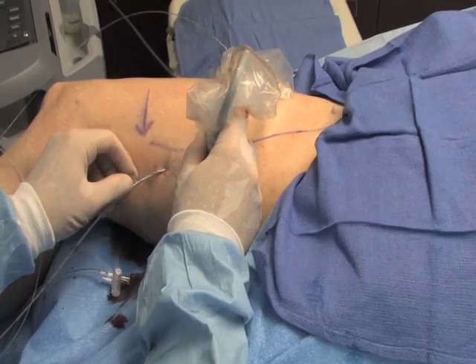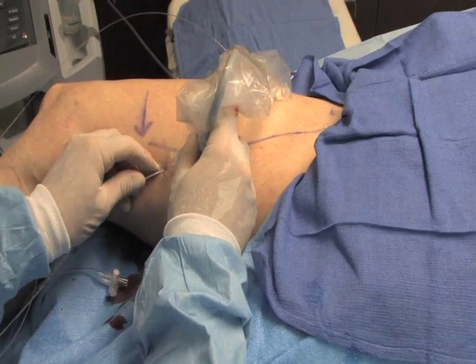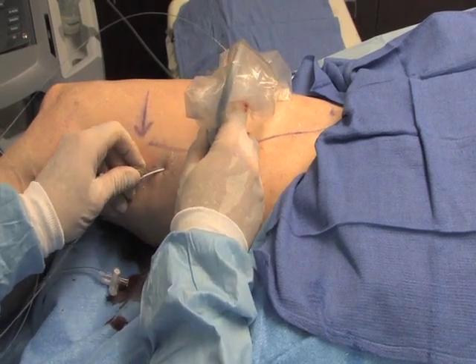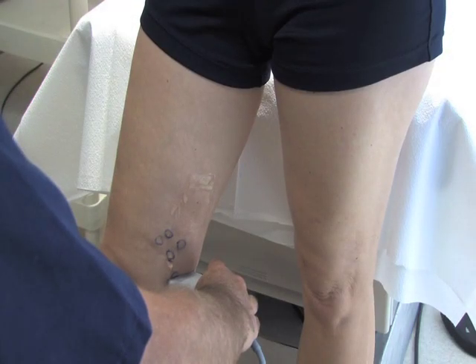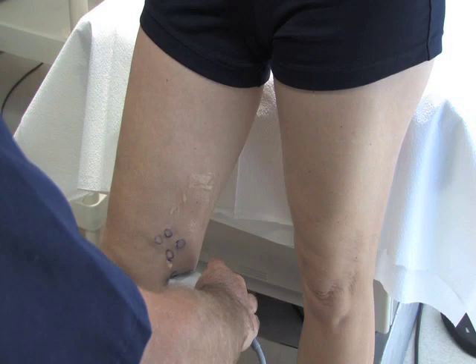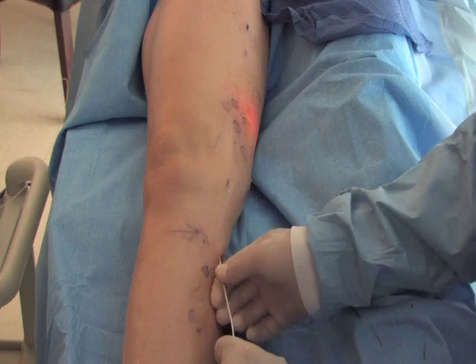Welcome to Mobile Medical Media's video review of ultrasound-guided endovenous laser therapy of the greater saphenous vein. This tutorial reviews how to use ultrasound to determine if varicose veins are caused by venous reflux and how to thermally seal the greater saphenous vein with laser therapy.